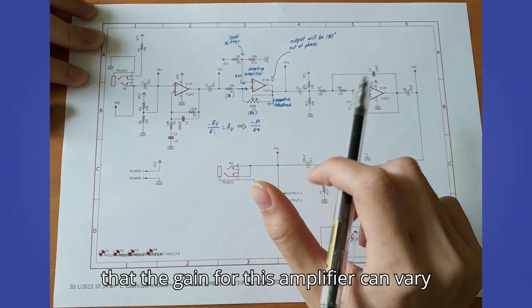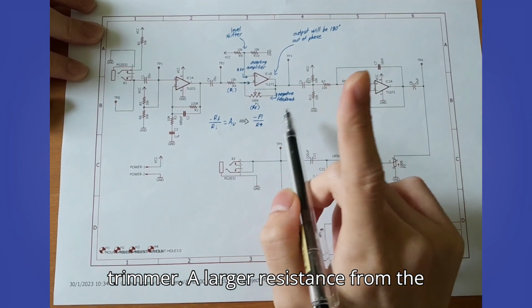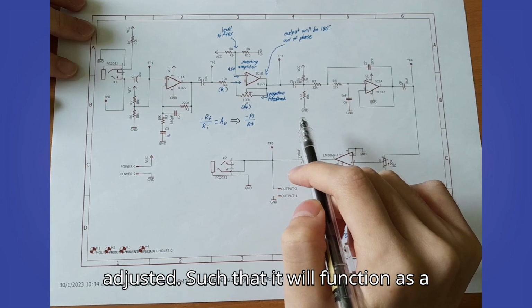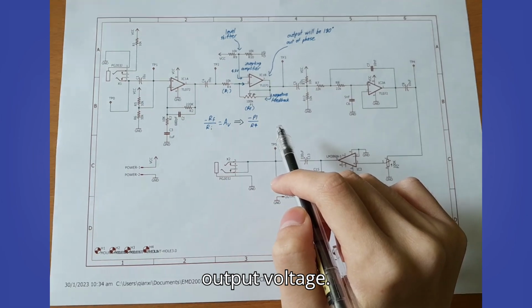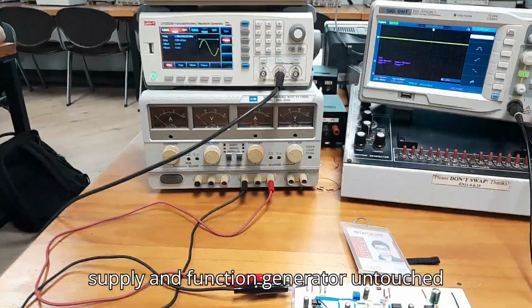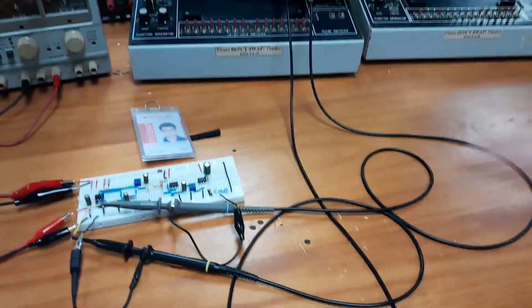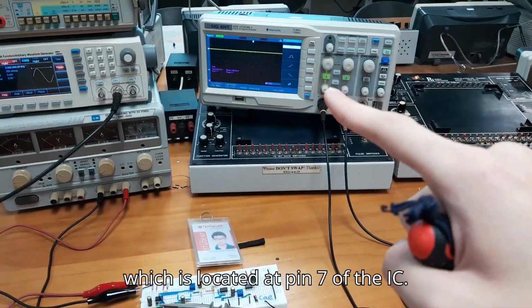This means that the gain for this amplifier can vary based on the resistance set by this trimmer. A larger resistance from the trimmer will result in a larger voltage gain. The gain can be carefully adjusted such that it will function as a linear amplifier and not saturate the output voltage. To set up stage 2, I left the DC power supply and function generator untouched and did not change any values. However, I now adjusted the oscilloscope cable connected to channel 2 to TP3 instead, which is located at pin 7 of the IC.